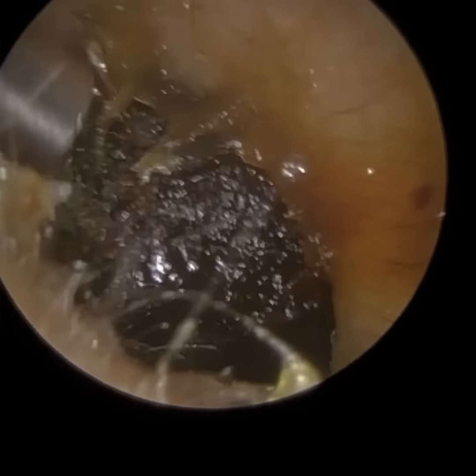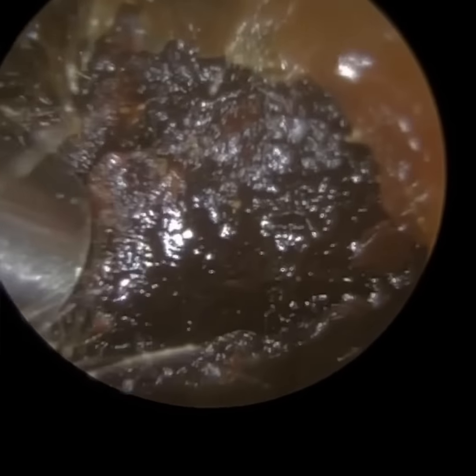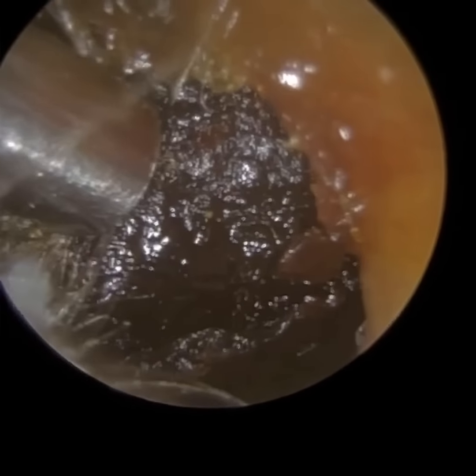Sometimes removing wax is like moving large furniture from one room to the other — it won't just fit through the door frame. You're having to manoeuvre the wax in certain angles and planes to get it through.